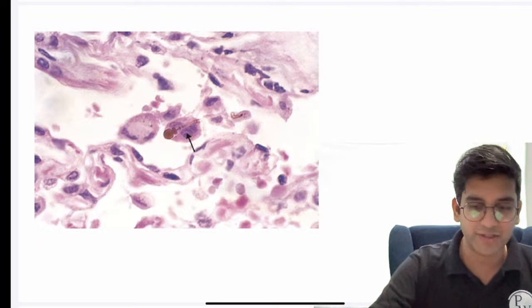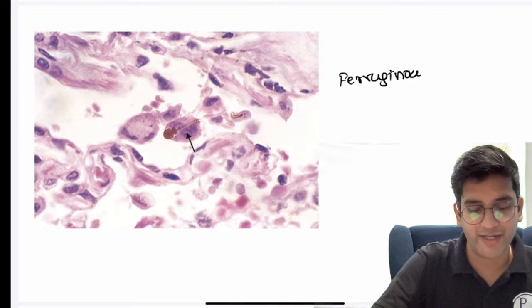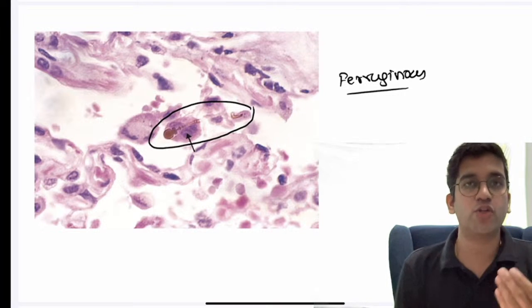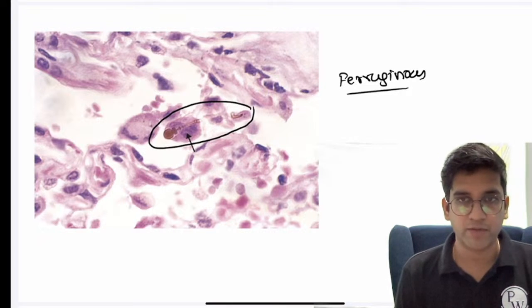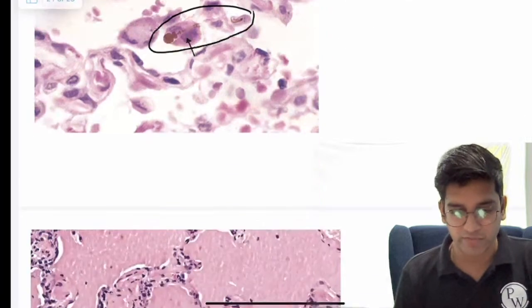That's a classical finding of an asbestos body or ferruginous body, right? It's a classical asbestos body or ferruginous body. In your NEET exam, you also had once a Perls-positive image as a blue color structure, the same way as your asbestos or ferruginous body, right? Perfect, amazing. Okay, a dumbbell-shaped structure, any such shape, that's an asbestos or a ferruginous body, fine.